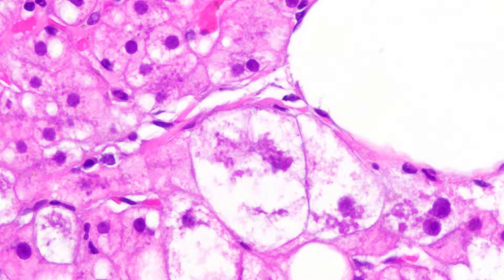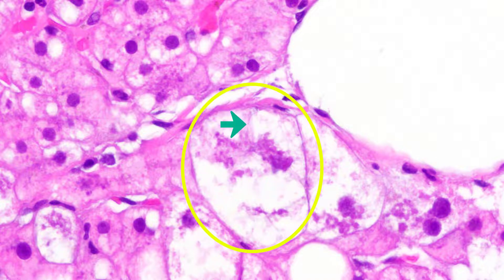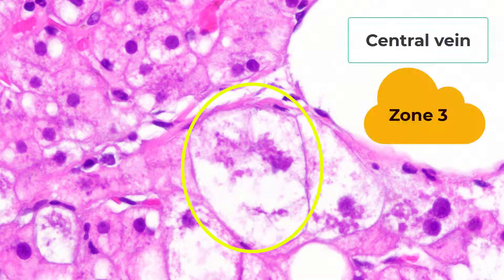Here's a classic balloon cell. It's enlarged, and they often have these distinct cytoplasmic membranes. There's the cytoplasmic condensation, the spidery processes, and the clearing. One additional helpful feature: balloon cells in steatohepatitis are typically located adjacent to the central vein in the zone 3 region — and there is the central vein.